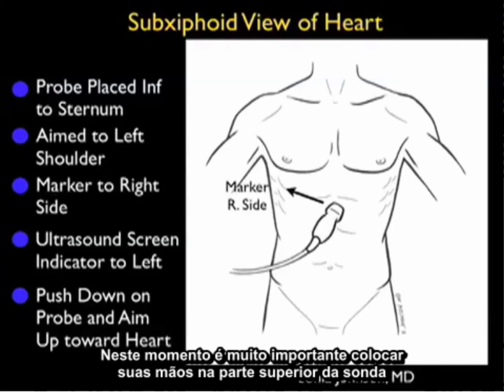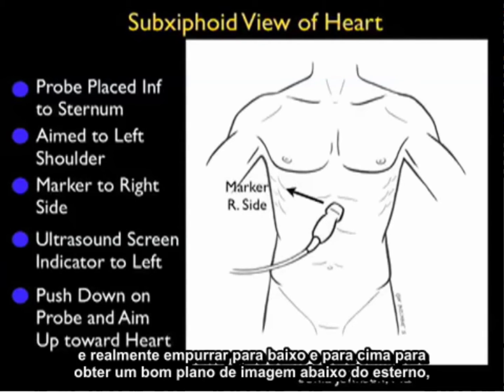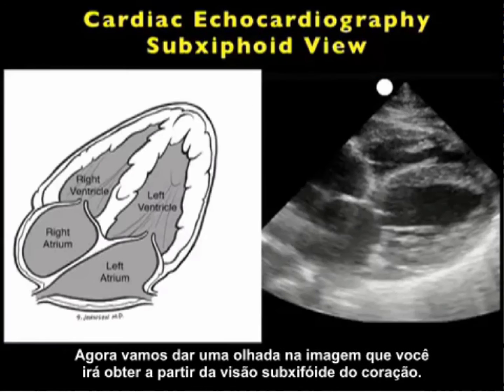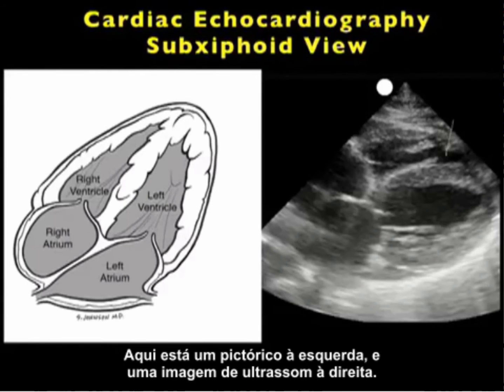It's very important to put your hands on top of the probe and really push down and up to get the good imaging plane underneath the sternum to make the angle to get a good view of the heart from this plane. Let's now take a look at the image you'll obtain from the subxiphoid view of the heart. Here's a pictorial to the left and an ultrasound image to the right.